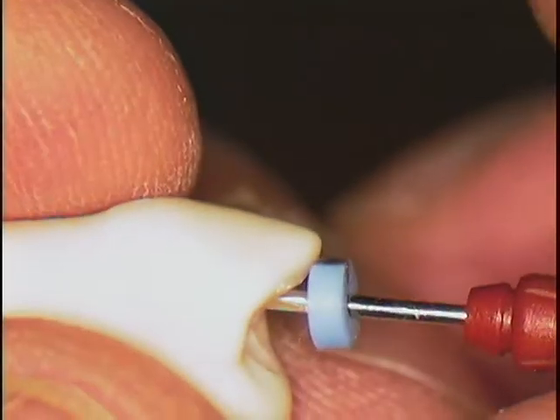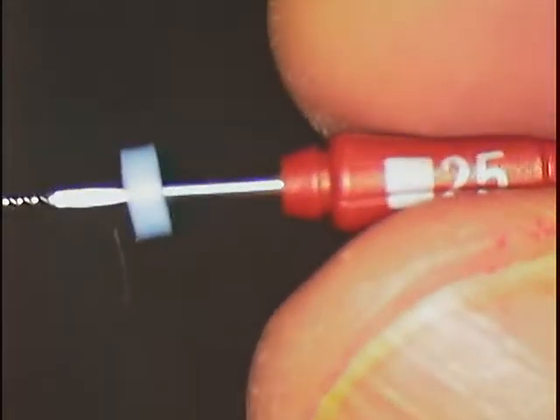So this one is pretty good. Let's stop. I'm going to take that back. I'm going to say, okay, this one is the start of my apical constriction. It's the red color, so I'll put that down. I want to check patency. It stopped right at that level. And I'm going to go back, check my patency. Maybe put a little bit of lubricant in there too before I do that. And then put that back.